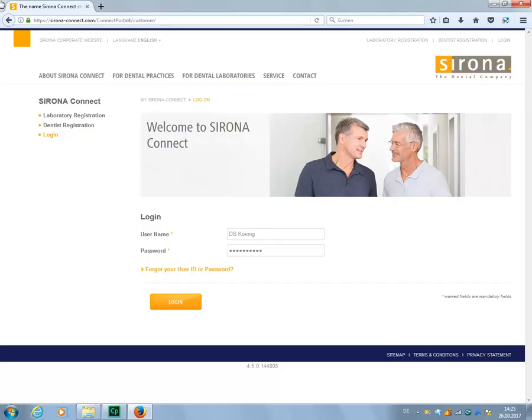Log into the seronaconnect.com website with your username and password. For our example, we have already created a profile and entered our user data and just need to click on Login.